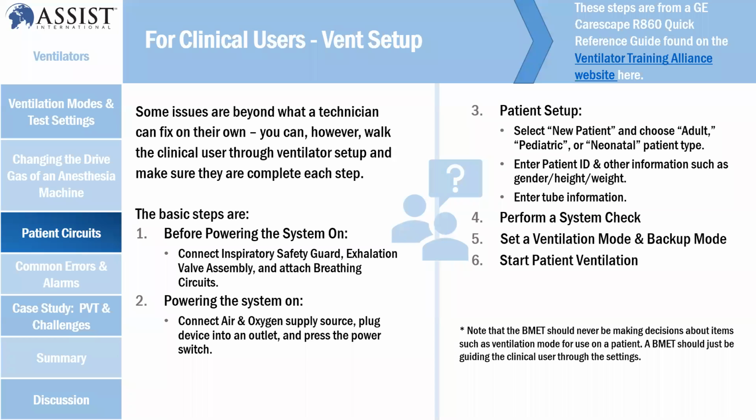Key in certain things and try to run the performance check, the self-check system, and see whether all the self-tests are passed. Then use the test lung to run a normal basic test, like 500 ml, PEEP, and see whether it is inside the range or not. So run a basic test. Once you've done that, the machine is ready.